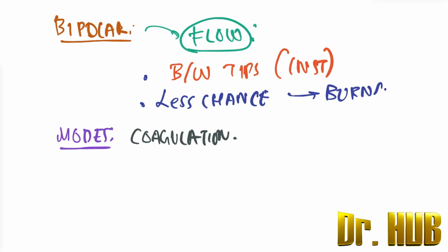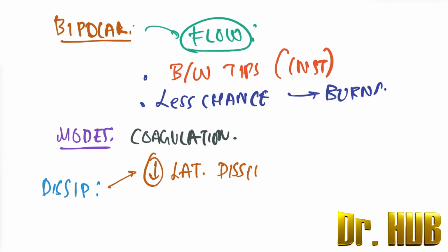And what about dissipation? In terms of dissipation, there is less lateral dissipation of current, and hence it is safer in procedures closer to the vital structures.